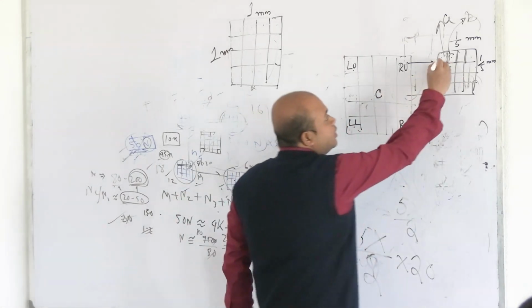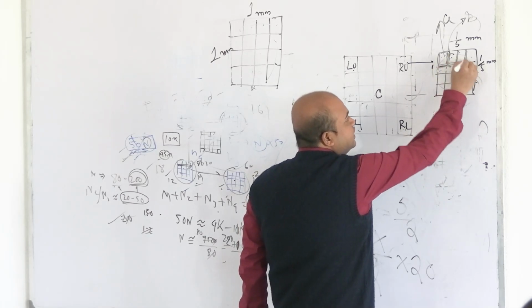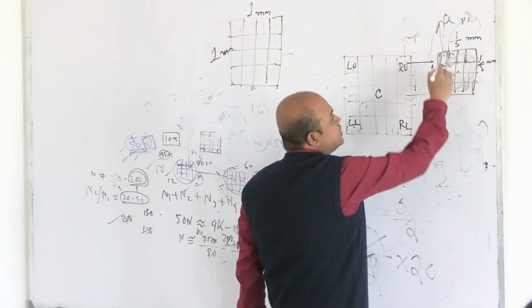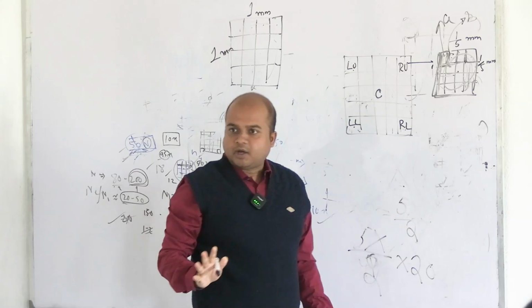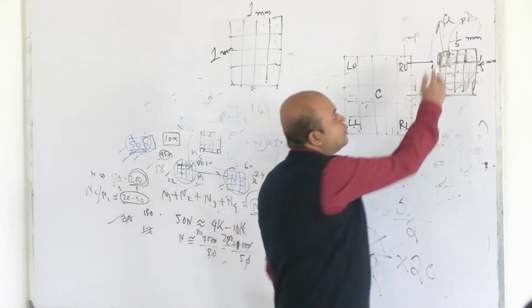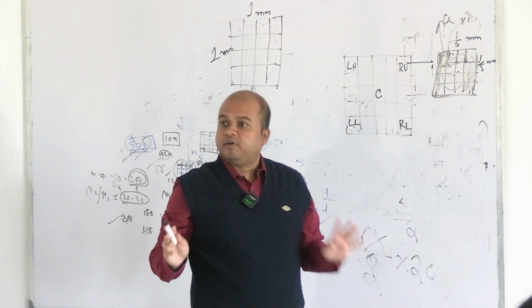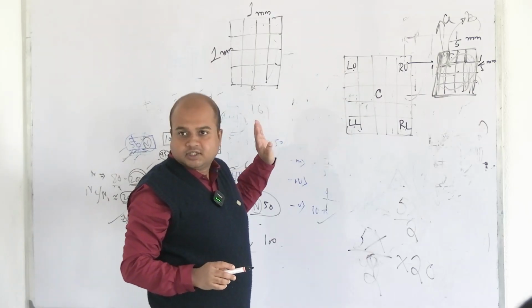Then what happens? This total has been counted, and what has been counted? This L, consider it as L, and so the whole central portion has been counted, and these left and lower margins have been counted after counting all the 16 squares. What is left is the right and upper margin of this whole 1 by 5 into 1 by 5 square. You count it at the last.